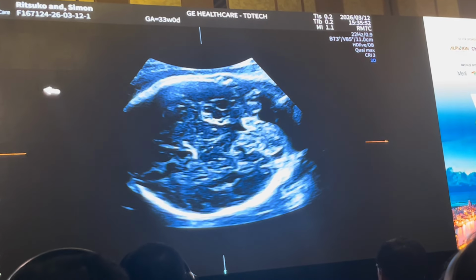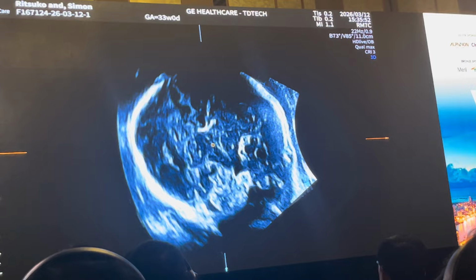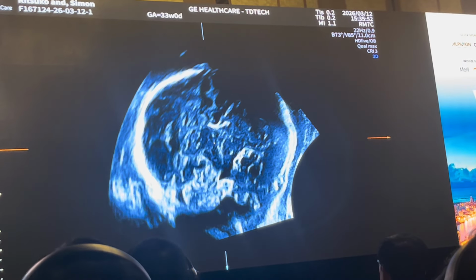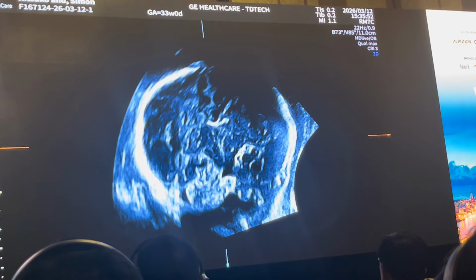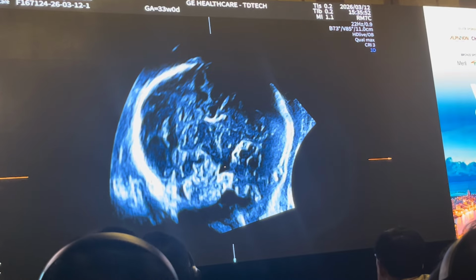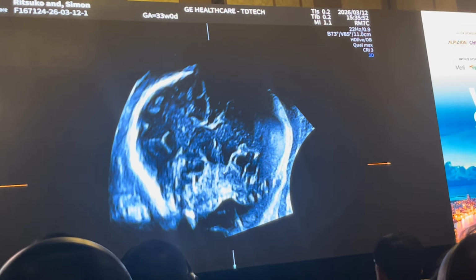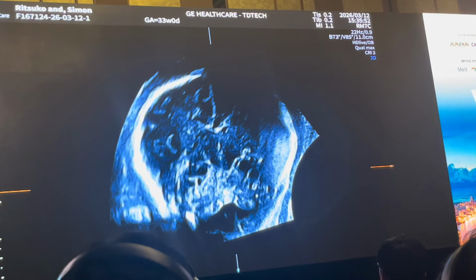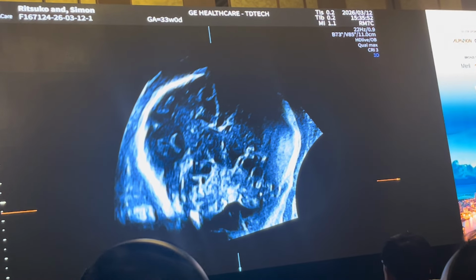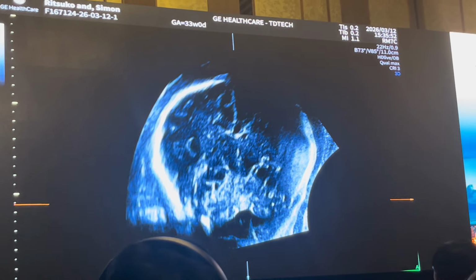If that's okay, then I will rotate around the z-axis. Bring it up towards 12 o'clock and place my reference dot inside the fourth ventricle. But my cerebellum is not symmetrical, so I will need to then translate through the volume until I make sure that my cerebellar hemispheres are symmetrical. And then once I have them lined up, I have my volume speckle reduction imaging.